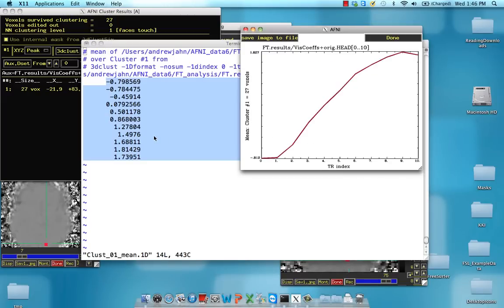So you can load these into Excel. You can do this across several subjects and then run appropriate statistics on that and make comparisons of different time points to other time points and see whether there are differences.